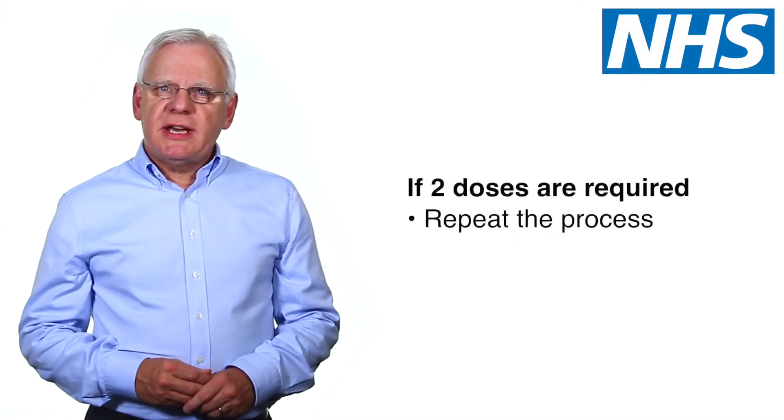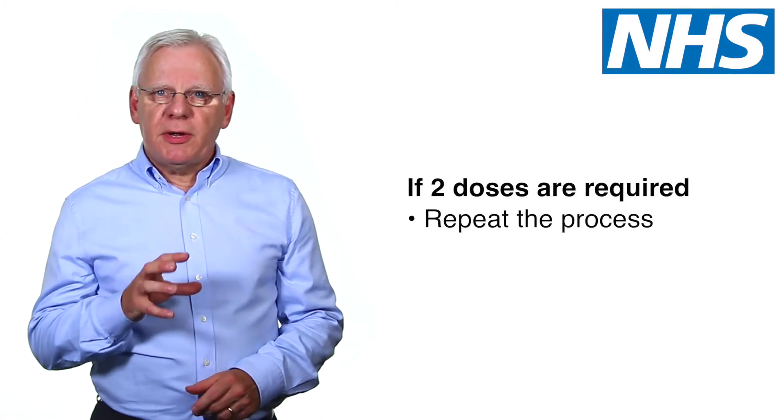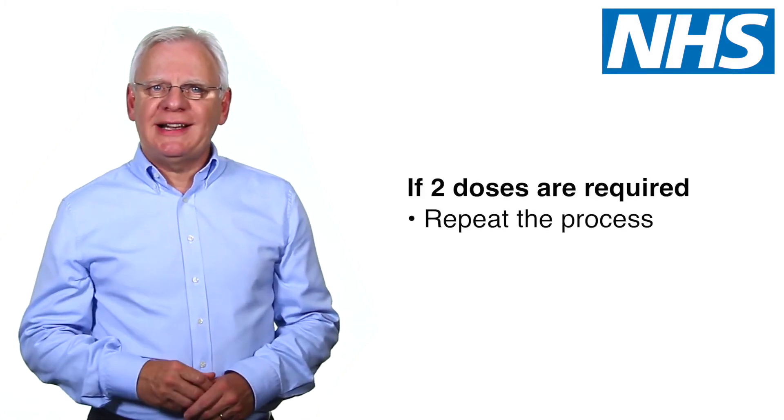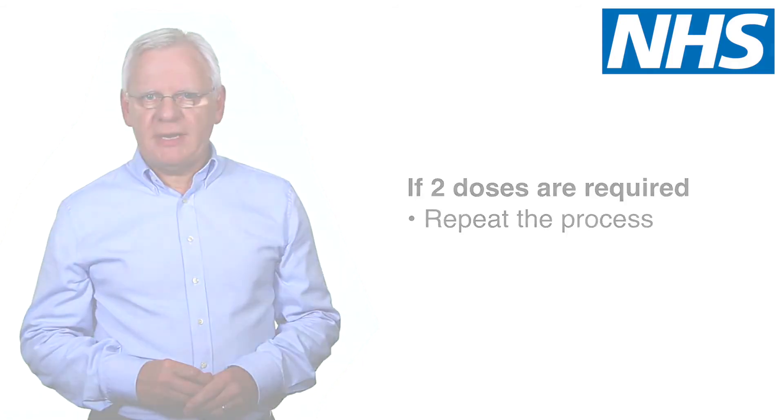If your doctor has told you to take two doses of medication, repeat the process. Start by opening the mouthpiece cover by folding it down until you hear a loud click. Once you're finished, close the mouthpiece until it clicks into place.